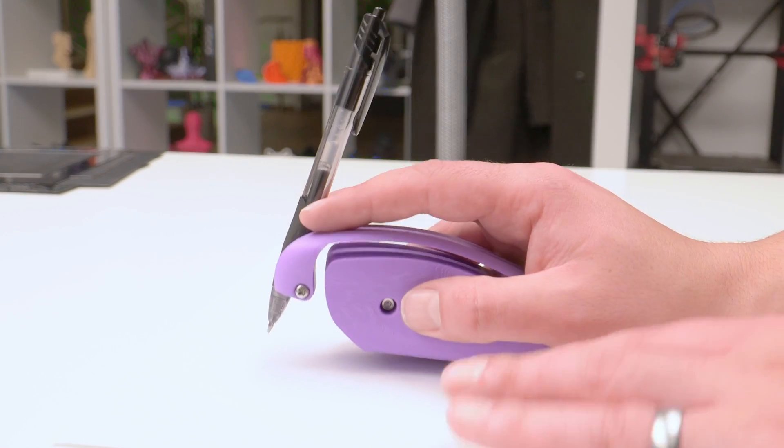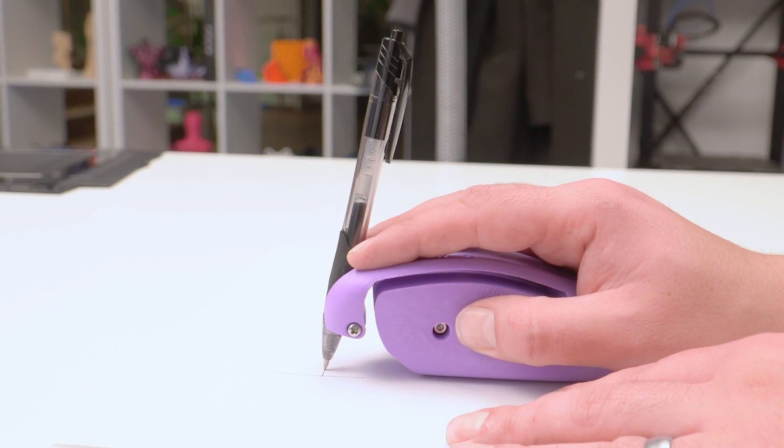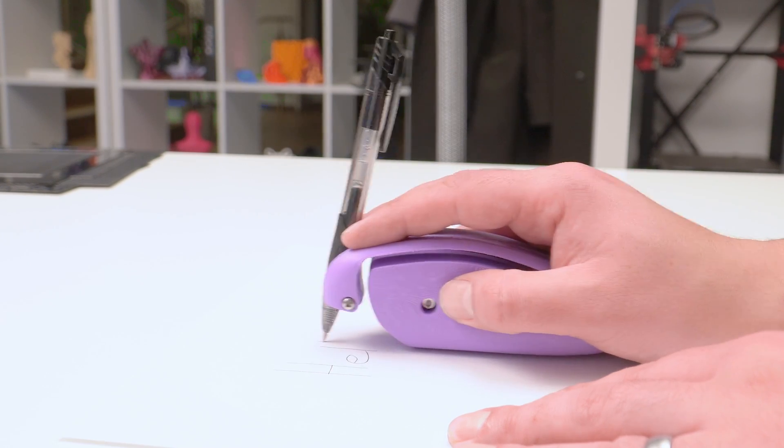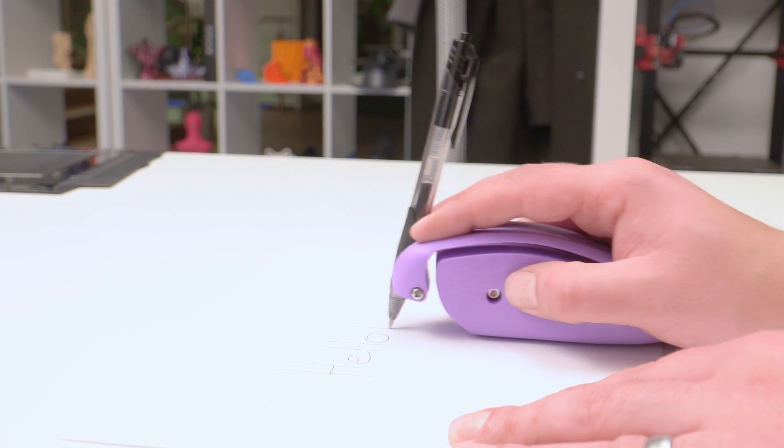This is the bottom line of why I love 3D printing. This is an open source, freely downloadable tool that is designed to make someone's life better. It is essentially a mouse-shaped device that enables anyone with mobility or coordination problems to write or draw effectively and without difficulty.